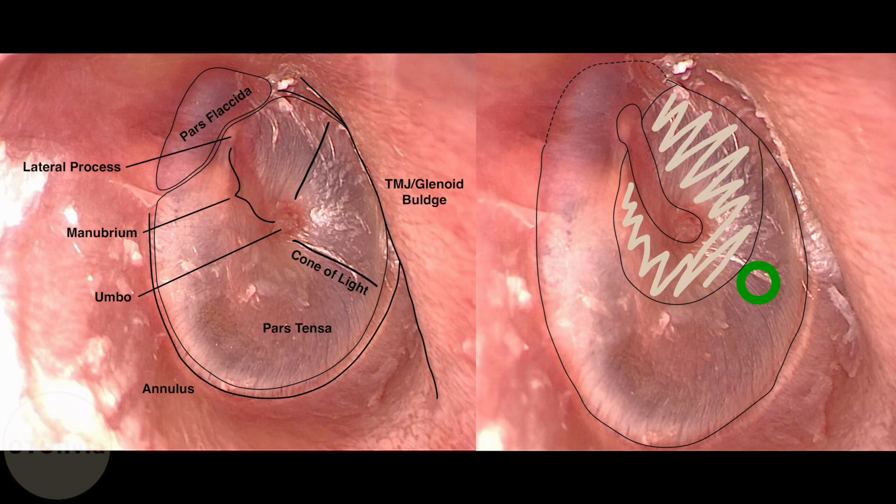Since it's hard to see through the speculum sometimes, here's what you can picture in your mind's eye. We have a right ear and the cholesteatoma is located primarily in the anterior superior quadrant, but it does extend wrapping behind the malleus and into a little bit more of the posterior mesotympanum as well. A green tube is in the antero-inferior quadrant abutting the very inferior anterior aspect of the cholesteatoma.